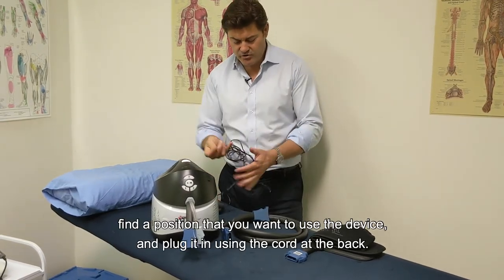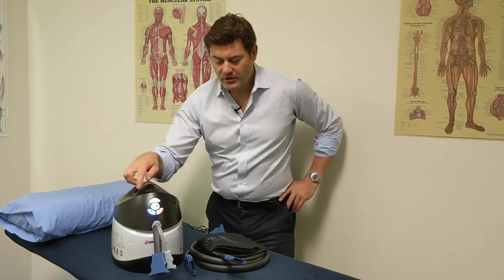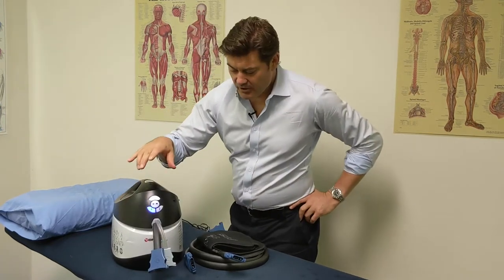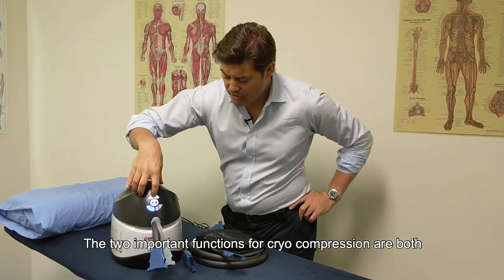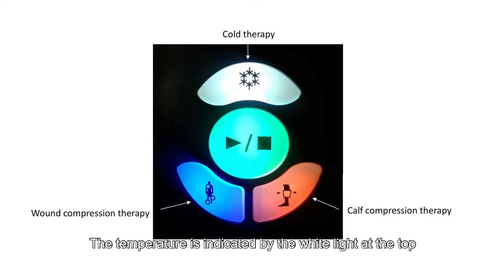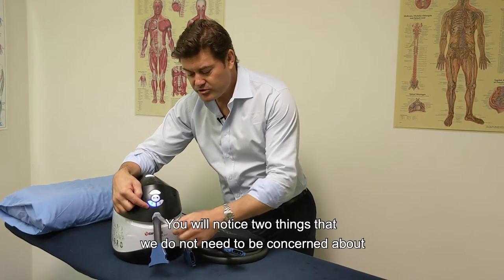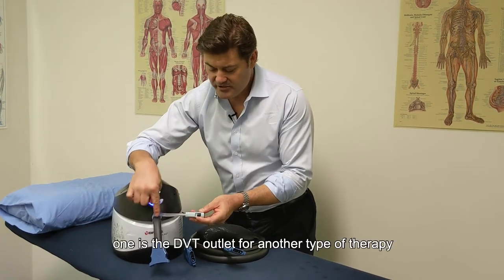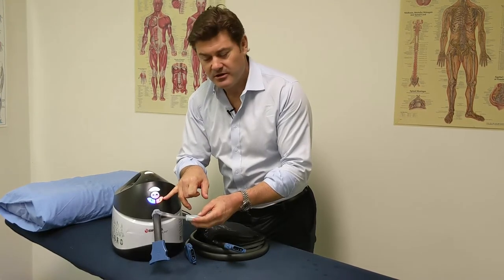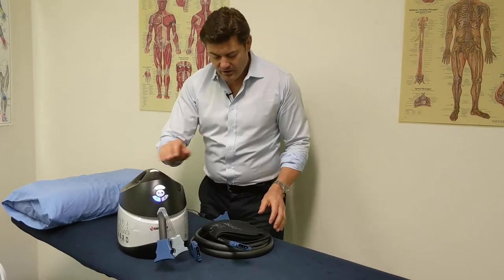Once your pump is ready, find a position to use the device and plug it in using the cord at the back. Once connected to power, look just above the two outlet valves at the front. The two important functions for cryo compression are temperature and compression — temperature is indicated by the white light at the top, and intermittent compression therapy by the blue light at the bottom. Note that the DVT outlet and the orange button are for a different type of therapy and do not need to be considered for your treatment.